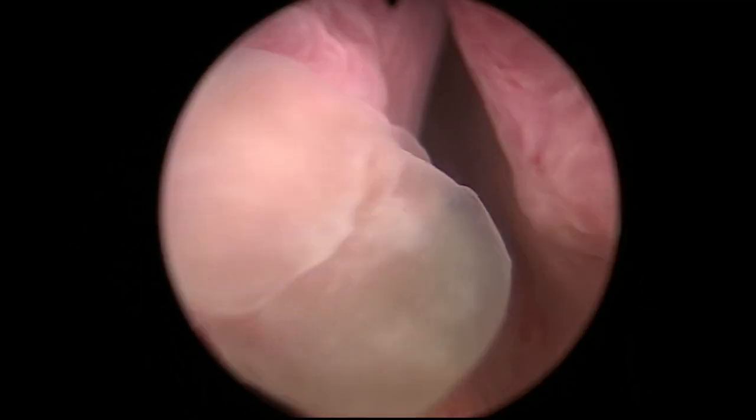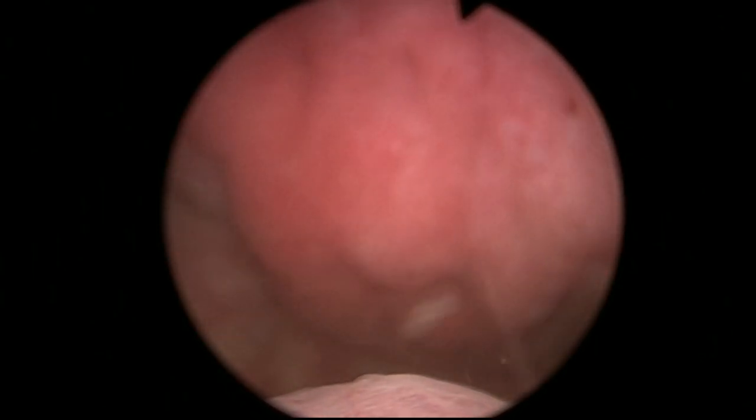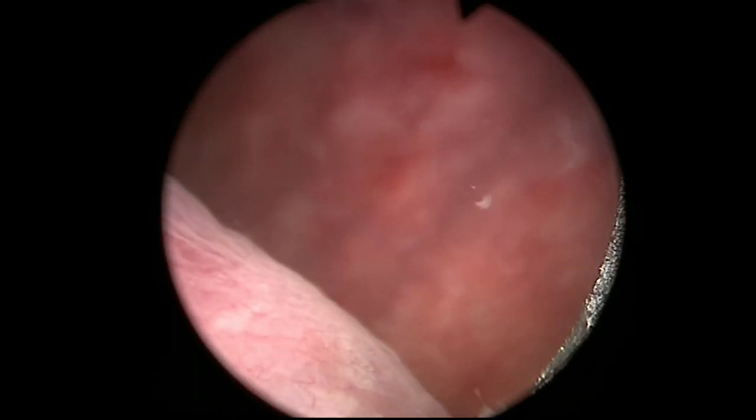As I said before, I was quite impressed by these laser hemostatic properties, and I managed to get Lisa to lend me a laser to learn and to perform some videos with my impressions of this laser, which is different from what I had been using normally, the Holmium laser. This is one of the procedures we have performed. As you can see, the urine was a little bit dirty, probably the result of chronic retention.